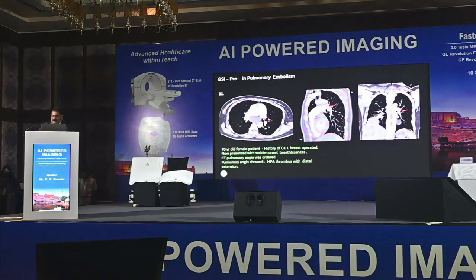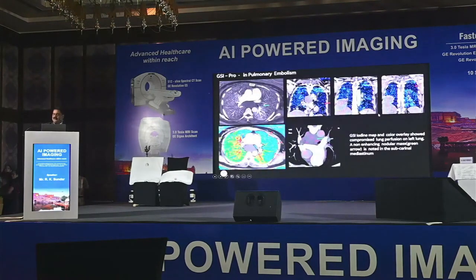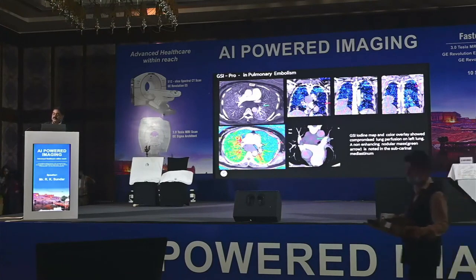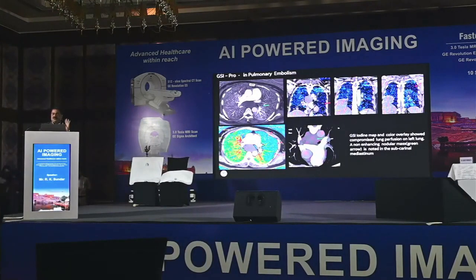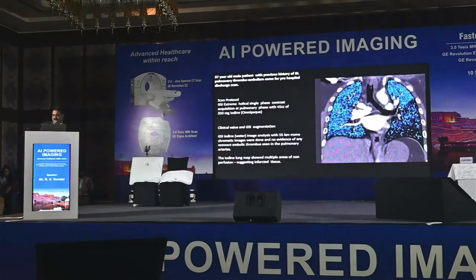Pulmonary thrombus imaging. In any normal CT, you will be able to easily make out pulmonary thrombus. It's easily visible. What spectral CT can give beyond it is iodine perfusion of the lung. That shows the functional lung volume clearly. What will be the patient prognosis? Or during the therapy itself, you can have a follow-up and say how much the patient has progressed visually, not only seeing the thrombus, but also visualizing the amount of lung returning to normal perfusion.